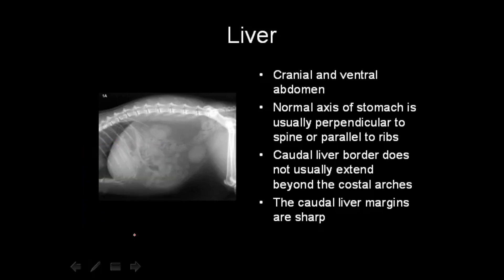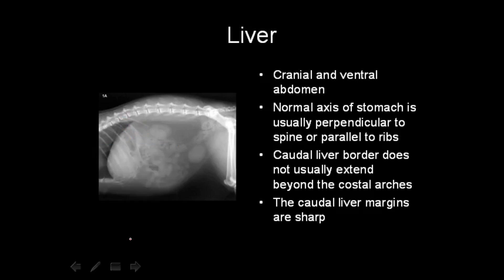The measurement we can use is the gastric axis, drawing a line from the fundus to the pylorus. This should be from vertical to the spine up to parallel to the ribs. So we draw a line from the fundus to the pylorus — that is the gastric axis — and this angle should be from vertical up to parallel, which is usually considered normal.